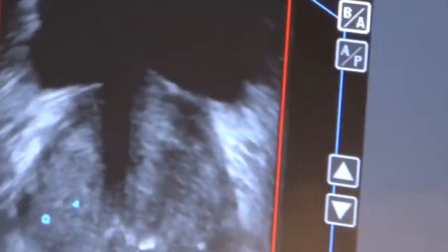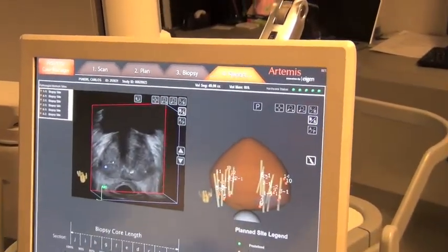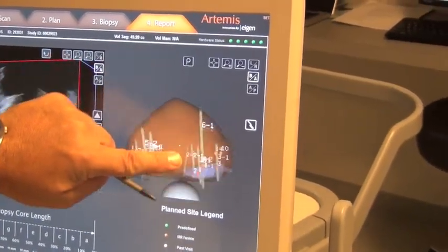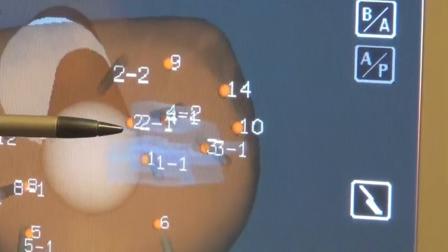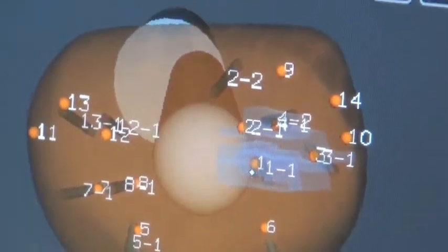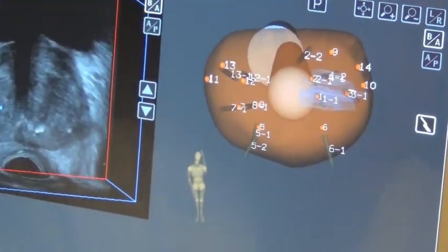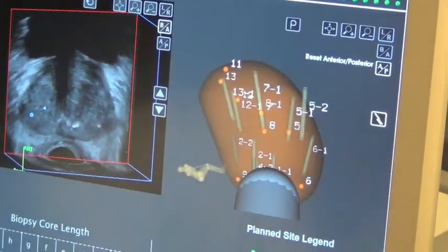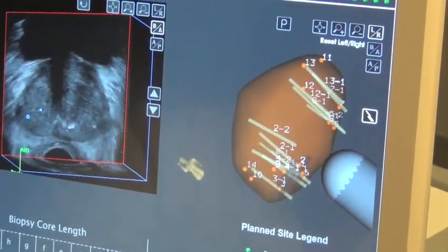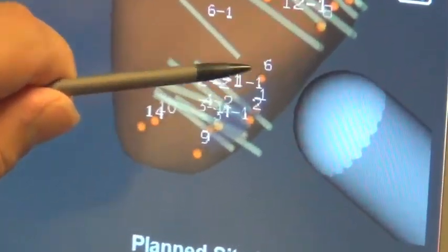If we look at that from a diagrammatic standpoint, we can see really nicely that those cores are really focused — no matter how we look at it, they're going right through the region of abnormality. Four cores going right through that region. We can also see how we've sampled the right side and got some samples out at the apex and base region on the left side we were worried about. Looking at it in the sagittal plane, we can again see the cores concentrated through the region of abnormality.